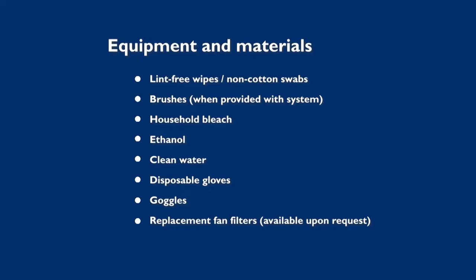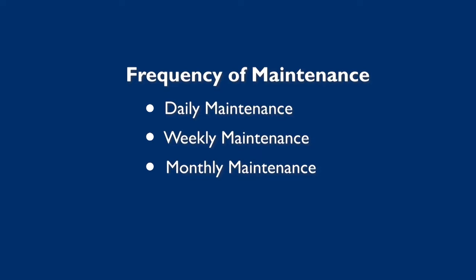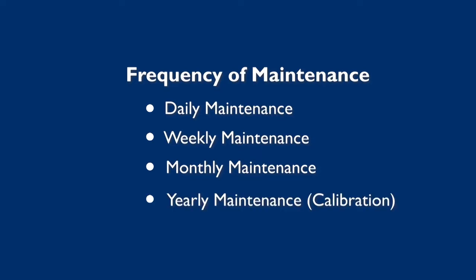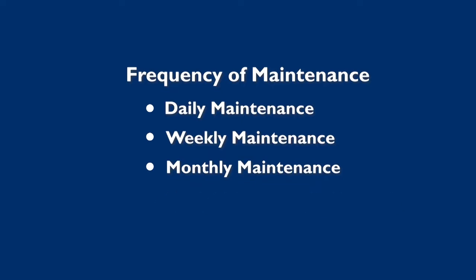The maintenance of GeneXpert system should be performed regularly by the end user — daily, weekly, monthly, and yearly. In this video, we will demonstrate daily, weekly, and monthly maintenance procedures. Yearly maintenance and GeneXpert module calibration will be demonstrated in a separate video.